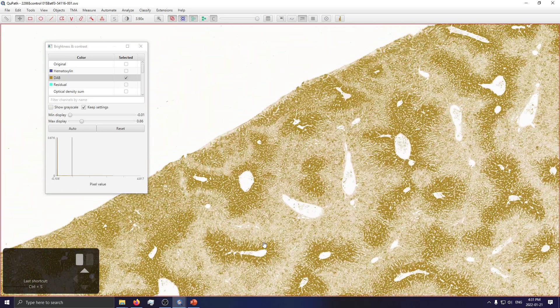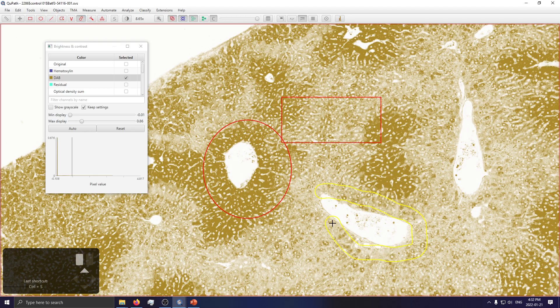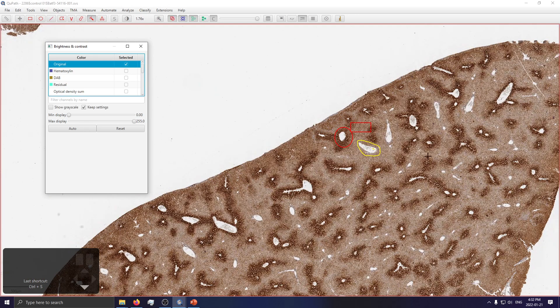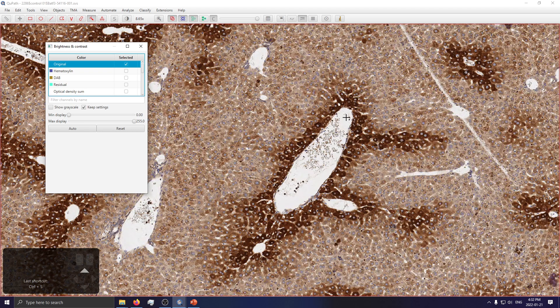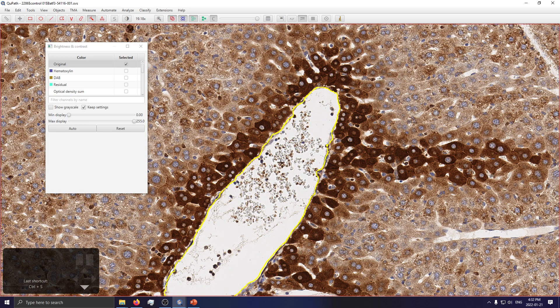If you wanted to draw someone's attention to a specific region, you can use the annotation tool — either draw a circle, draw a square, or outline a small area freehand and fill it in. Or maybe you want a crisper snapping tool — you can use the magic wand tool to snap perfectly to a structure, like the lumen of a blood vessel. You've just highlighted the lumen of a blood vessel — it has quite a few erythrocytes, maybe a couple of immune cells scattered around inside of it.